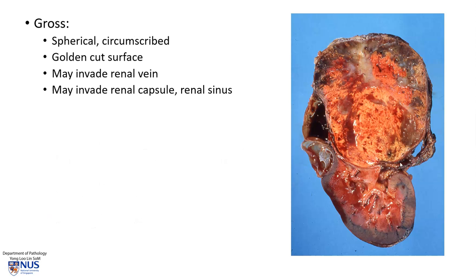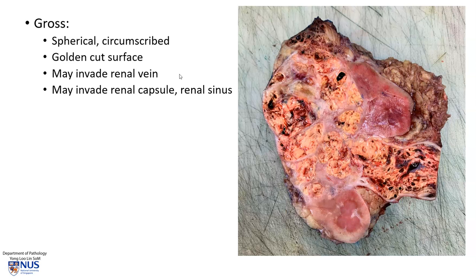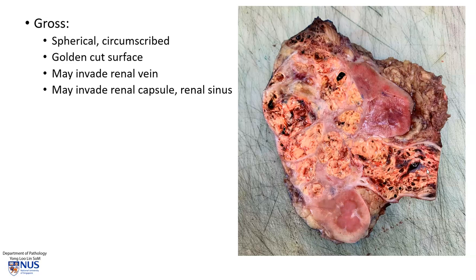Grossly, these tumors tend to be relatively well-circumscribed and rounded or spherical, and they have a very beautiful golden appearing cut surface. This correlates with the microscopic appearance we saw earlier because these cells are full of lipid, hence giving rise to this golden appearance. The tumors also have a propensity to invade into the renal vein — here is an example where we can see this golden yellowish tumor actually crawling into the renal vein — and these tumors can grow all the way into the inferior vena cava. The extent of propagation in these large vessels is important in staging.